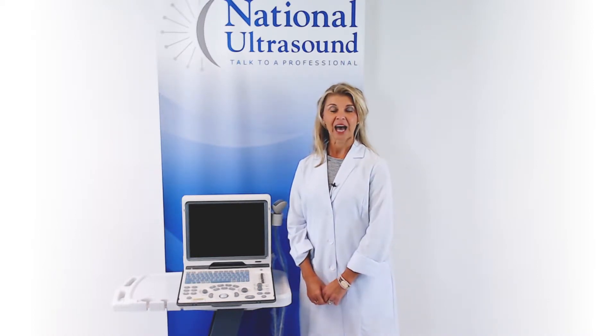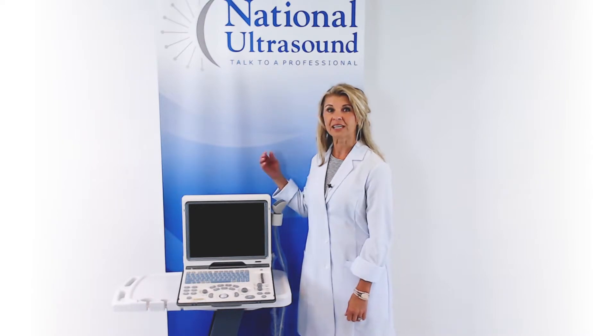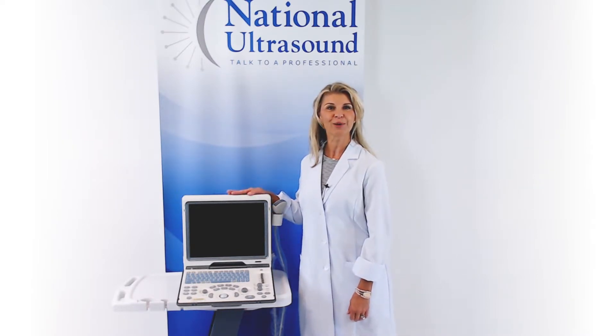Today I'm going to give a quick review on the Mindray DP50 black and white ultrasound machine. The DP50 is currently Mindray's most popular black and white system with thousands of units being sold.